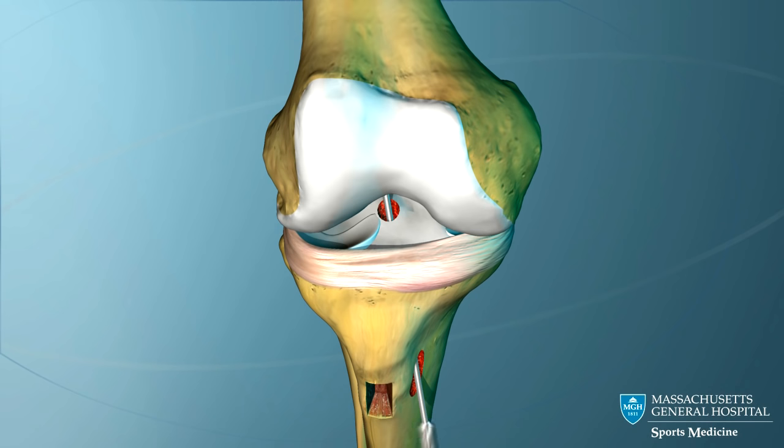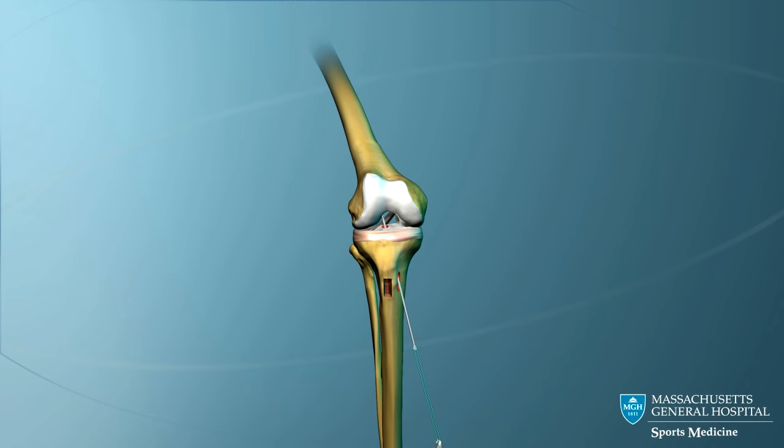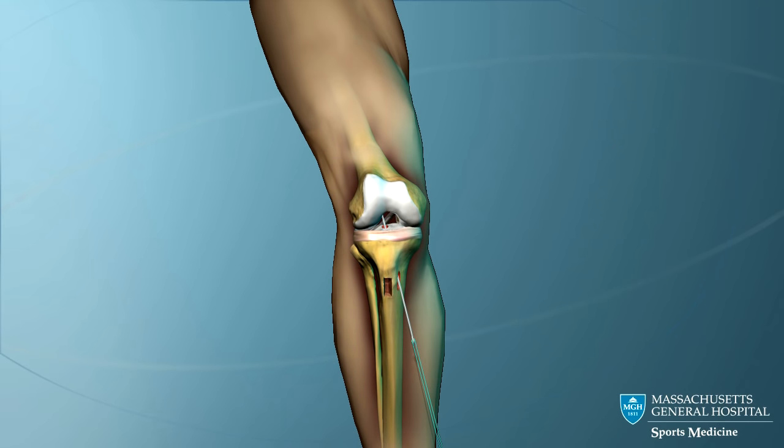The pin is over-drilled to the appropriate depth. A long guide pin is now passed upward through the tibial tunnel.